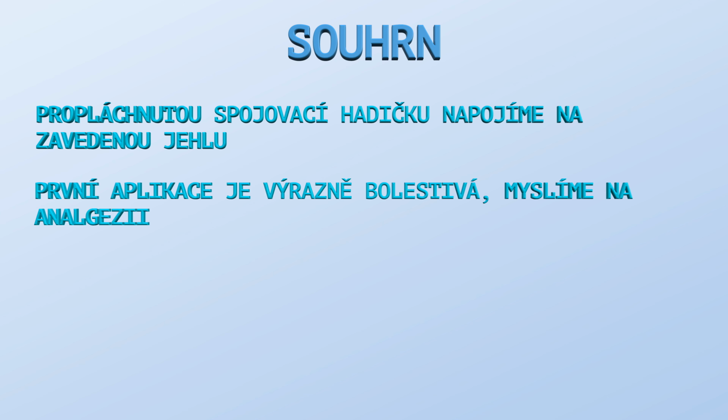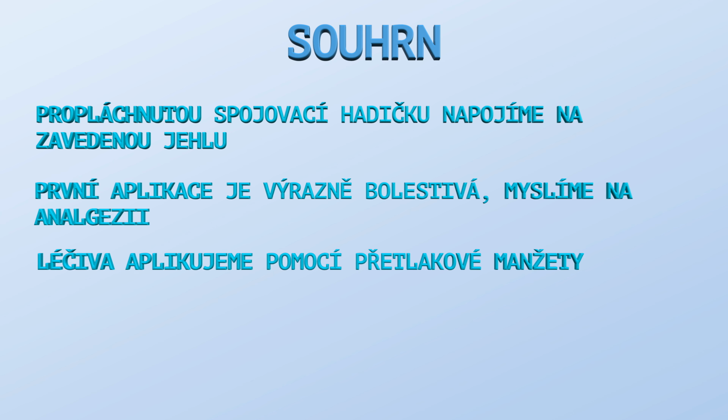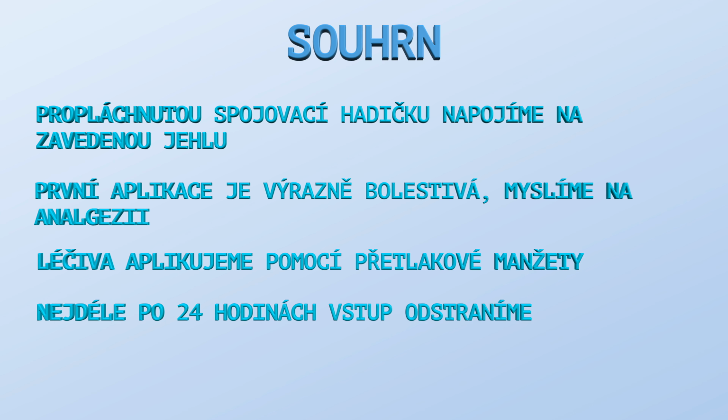The first application is significantly painful. Analgesia must be considered. Medications are administered using a pressure cuff. The access should be removed no later than after 24 hours.